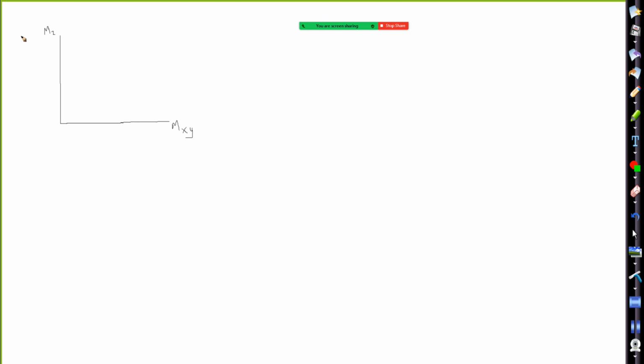All right. And then we have our first magnetic field, which was B sub 0, which was static. It's not moving. And so our net magnetic vector aligned with B sub 0 along the longitudinal axis. So I want to draw that vector in a different color here. Okay. And we know we created this net magnetic vector by having an excess of spin-ups, which were our low energy hydrogen protons.